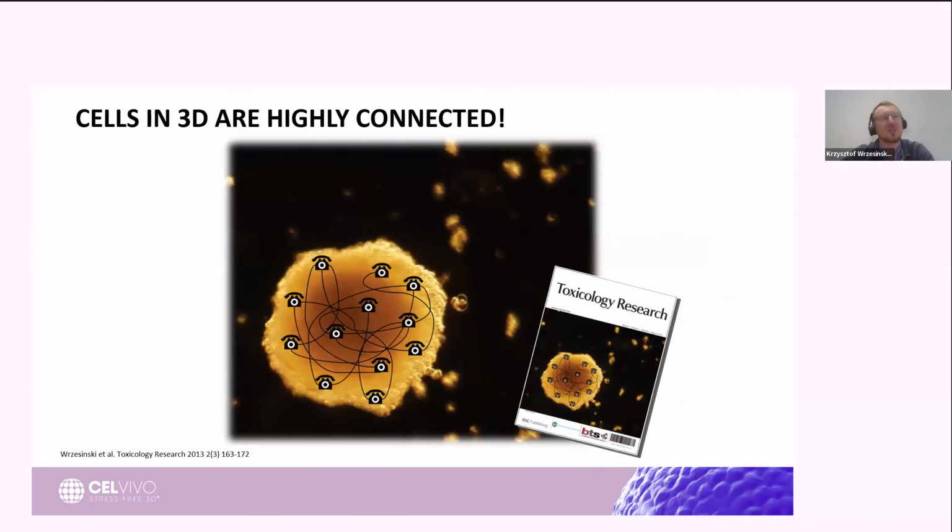So, going to 3D models, meaning the creation of biological constructs with a co-localization of cells in a three-dimensional structure, this creates a physiological environment which promotes cellular communication and develops tissue-like functionality. Again, much more is described in this article, published a long time ago.